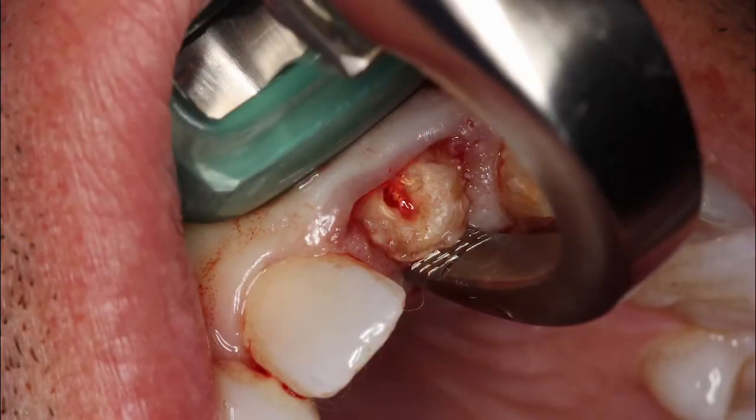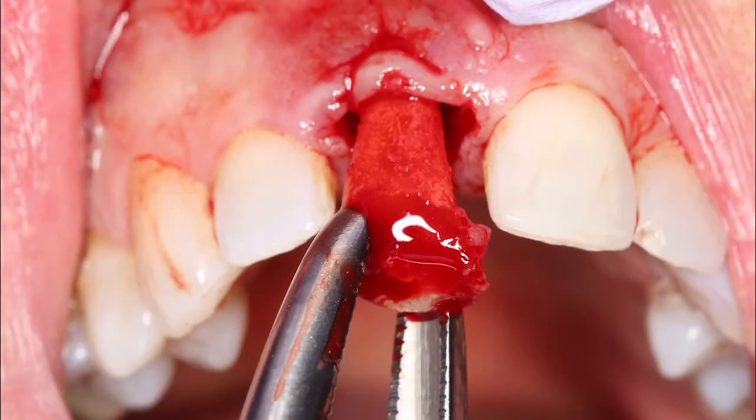In Figure 4, we show the physics forceps being used to atraumatically remove the root structure, maintaining the facial plate of bone, and thus facilitating predictable immediate placement of a dental implant.